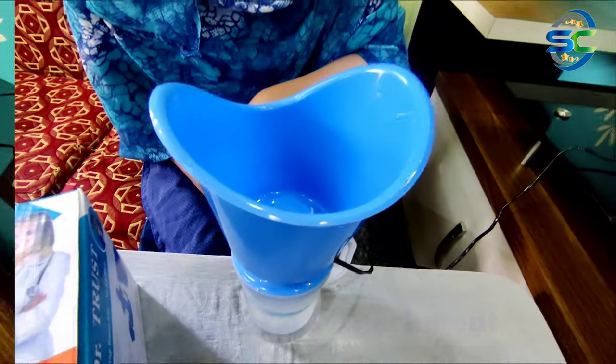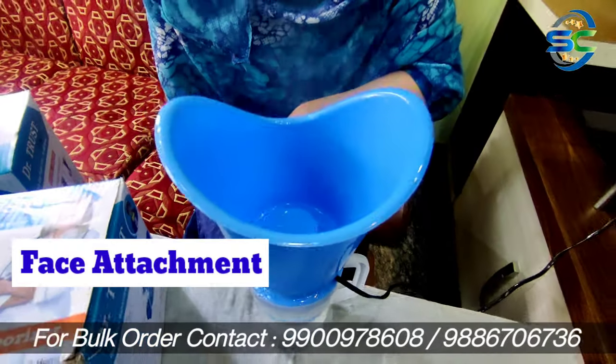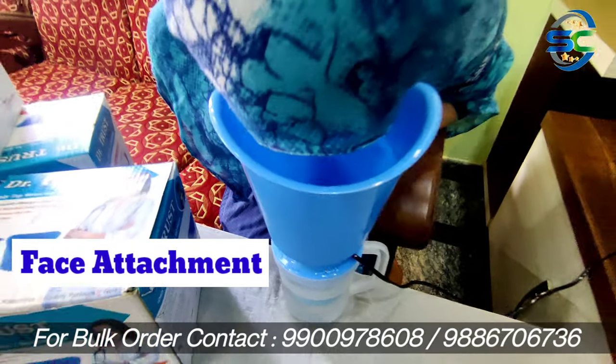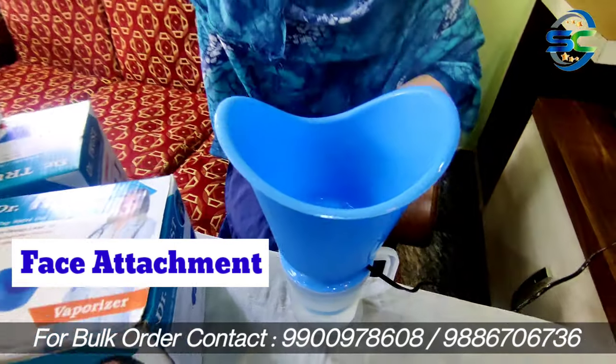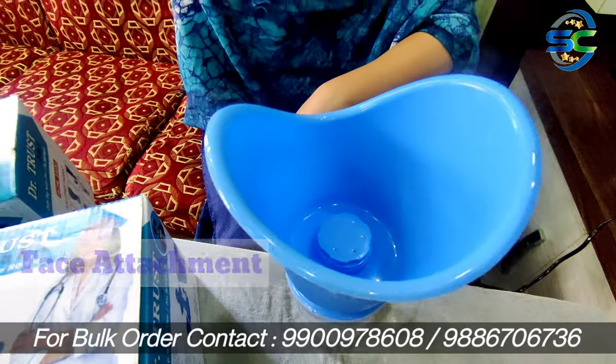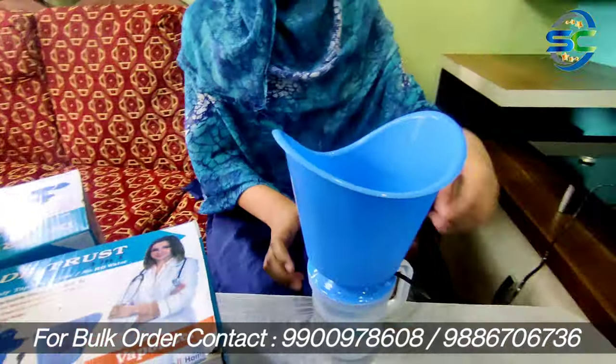We need to use it twice a day. Remember the duration of each session. After use, we will be able to clean the nose attachment and dry it properly.